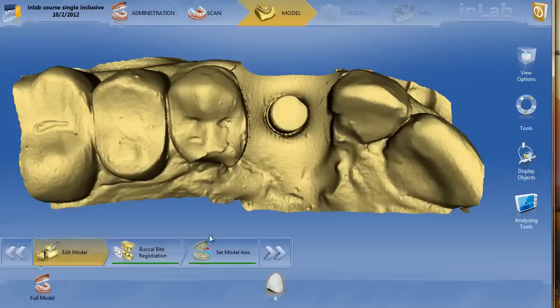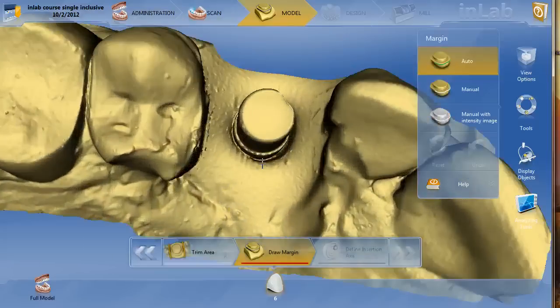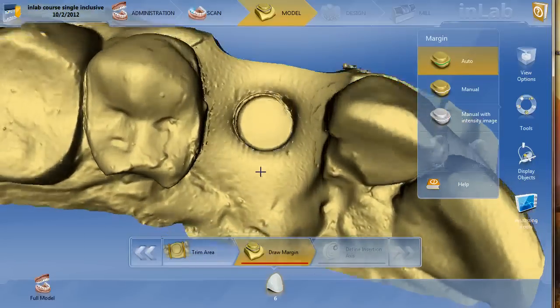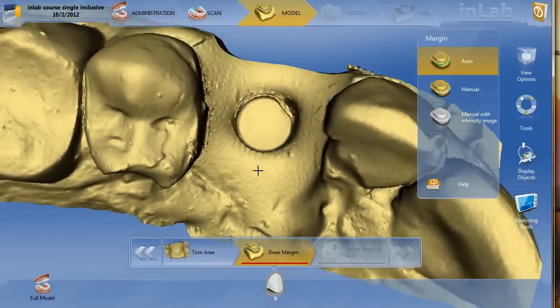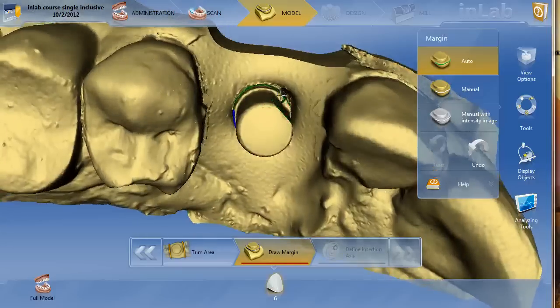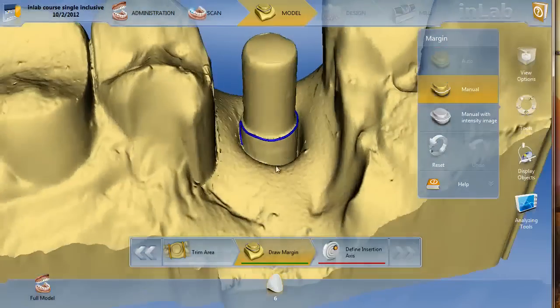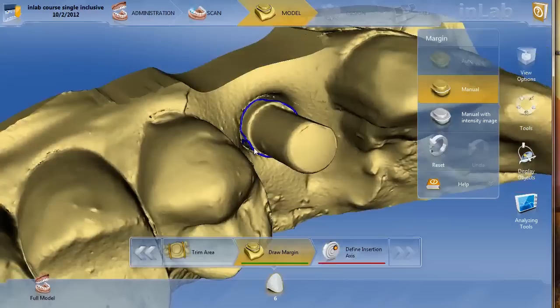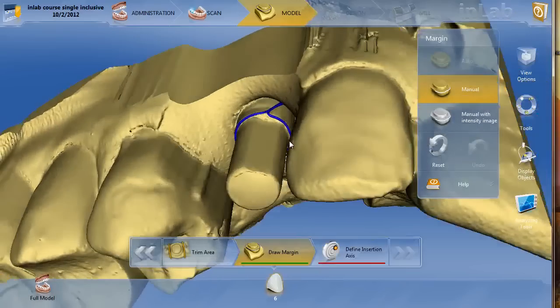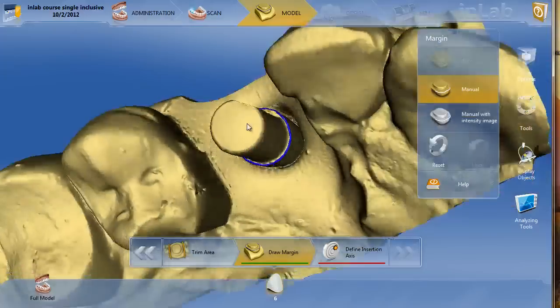Once you're done with this step, you do the buccal bite, you set the model axis, and we'll go on to the next step. The actual hardest part of using this Glidewell — especially the smaller ones, I believe this is a 4.0 Astro — is actually drawing the margins because you can't really see them. You basically just have to go around and quickly do the best you can, then edit it as necessary. You can see we fell off in a couple of different areas. Once you've got your margins drawn, we'll move forward.